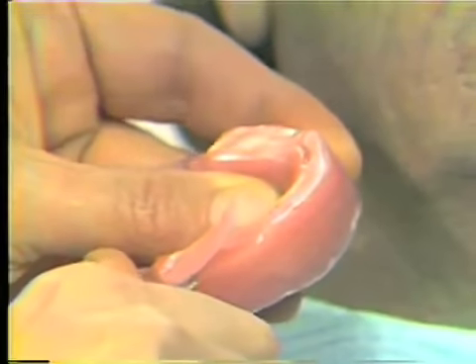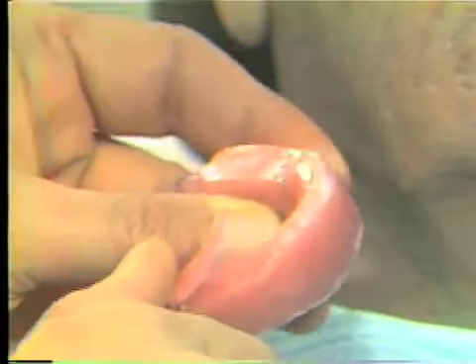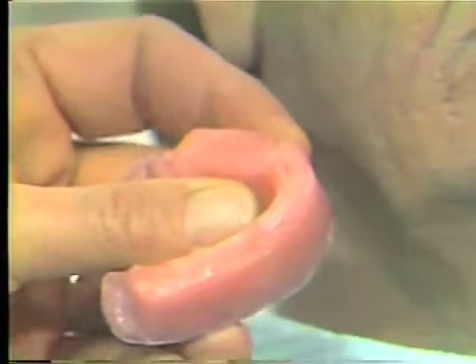Now, when we place this back in the mouth, you will be able to see the only contact is in the front portion. There will be no contact in the back portion.